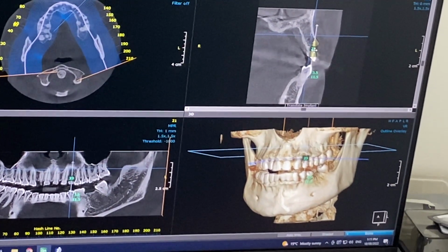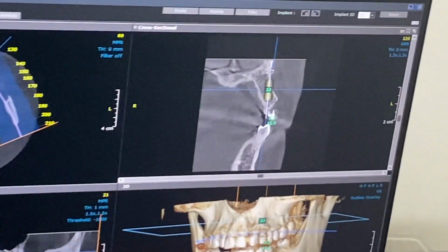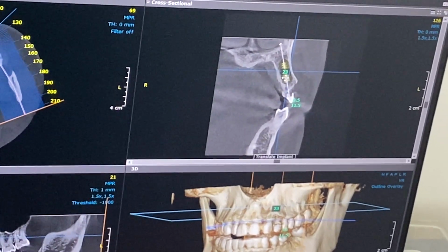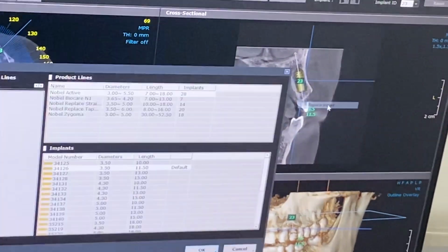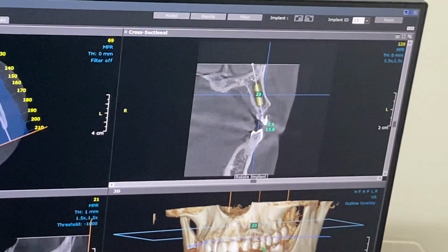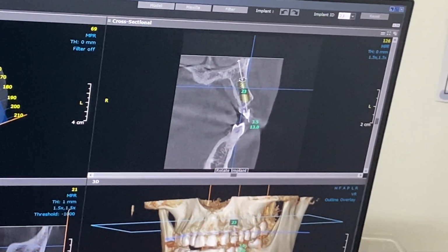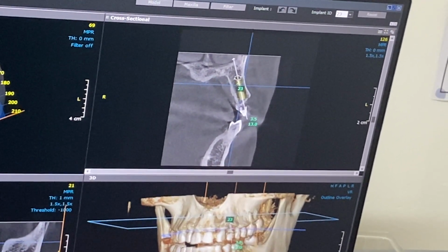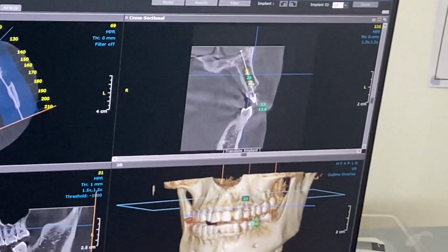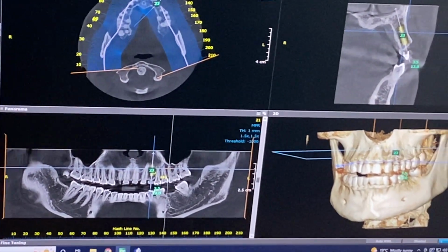As soon as I do that, I can then move the implant into position. And I do this with the patient beside me. It's very helpful. They can see what I'm doing. It's probably a little bit short, so I'm going to replace the implant and go slightly longer. There, and it's got a zone of exclusion, which I can vary if I like around it. You could probably go a little bit longer on this one. You might even go longer, just for the exercise. So there's our implant. You'd refine this nicely, but just for example, I'm showing this to the patient.